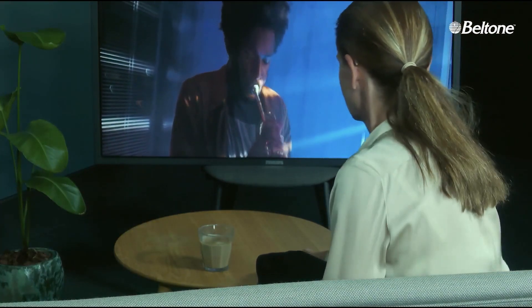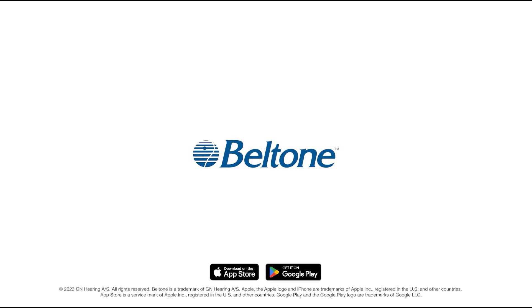She places the phone back on the table and sits back on the sofa. Beltone logo. Download on the App Store.